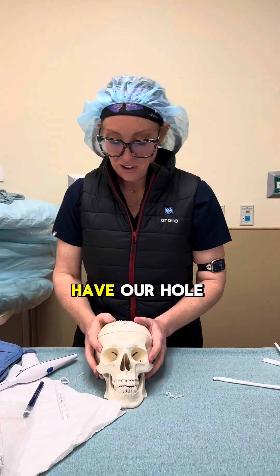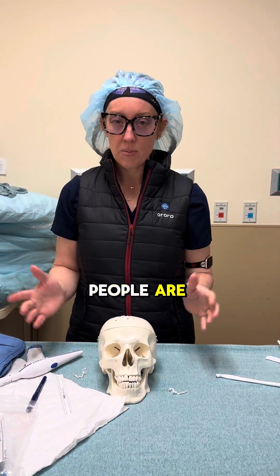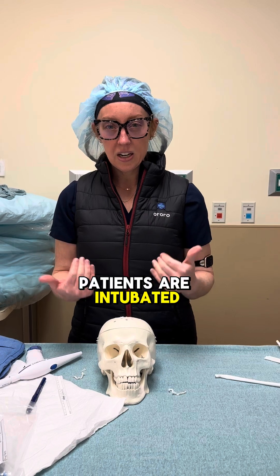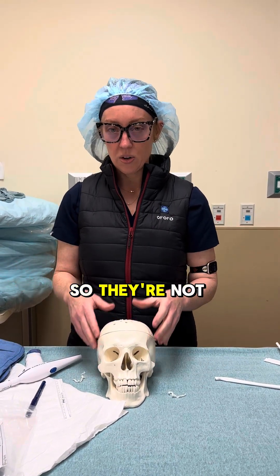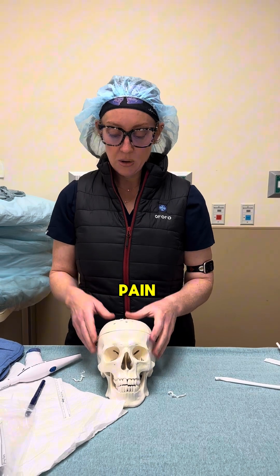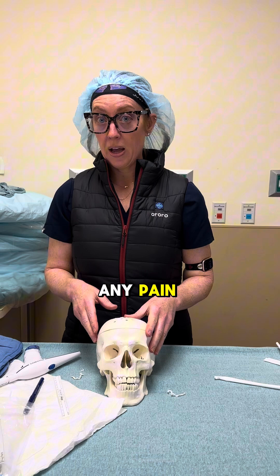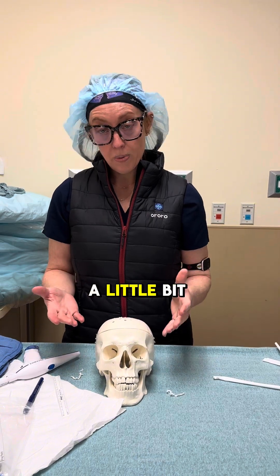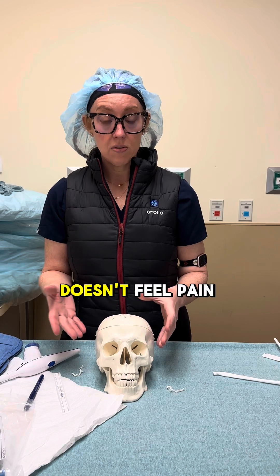Patients who need this procedure are not always wide awake. More likely than not, these patients are intubated and sedated because they're in an emergency situation with brain swelling, so they won't feel pain. We can use local anesthetic or numbing medicine to reduce any pain if they are more awake. It's not really a painful procedure — the brain actually doesn't feel pain.